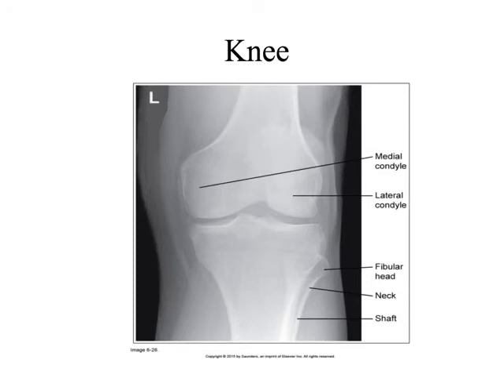I think honestly, a lateral knee is about one of the hardest things that we do and do well. When you get a good lateral knee, you should feel accomplished. It's a deceptively difficult joint to image. All right, we want to see the medial and lateral femoral condyles, right? What are we talking about? These little guys here, right? So this bony junk here, the medial and lateral femoral condyles.